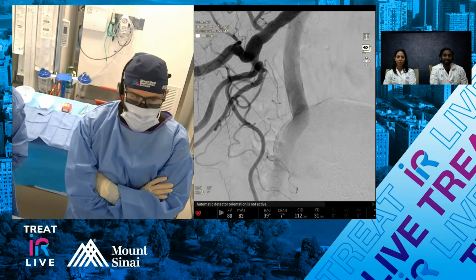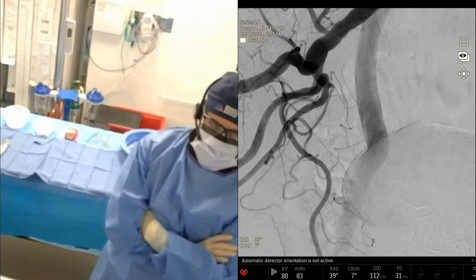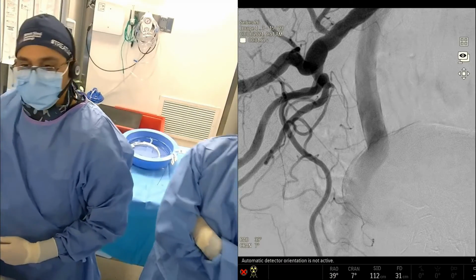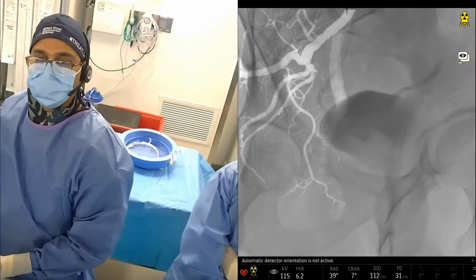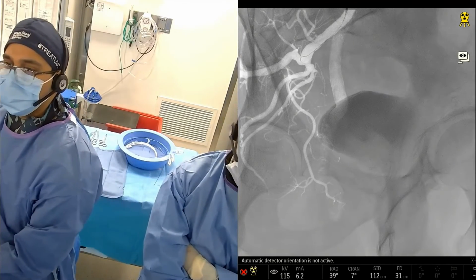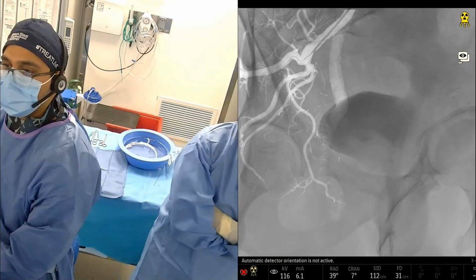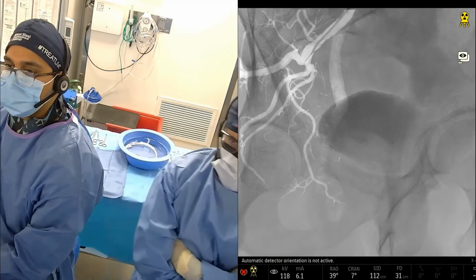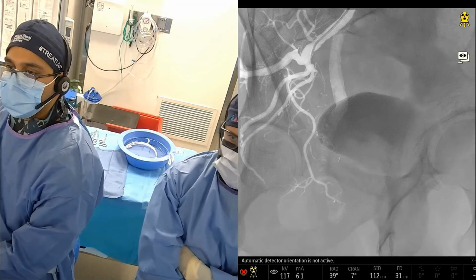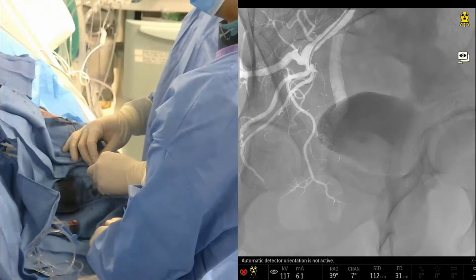And again, I think that kind of comes back to what we were talking about with microcatheter selection. Using like an angle True Select or something like that. If you really have a challenging origin, especially starting out, use what you're comfortable with. And if it's really going to be a tough situation, that True Select is a 2 French, 2.8 to 2, and especially in tall patients, you're going to get 175 length out of it. But it's really what you're most comfortable with. The Sniper obviously tracks really well, as we saw in the other one with a type 5.